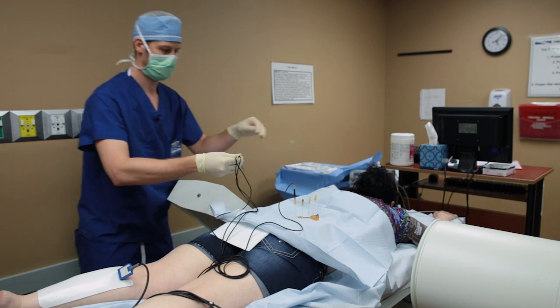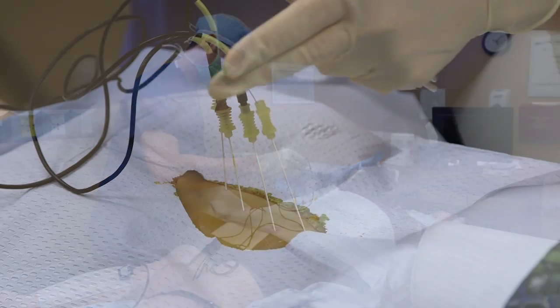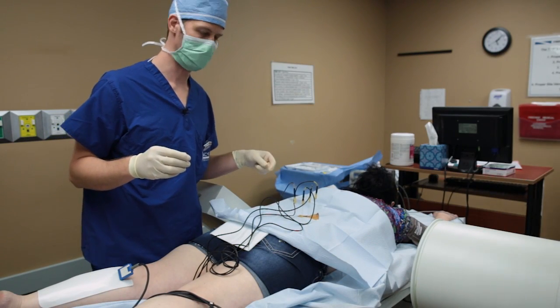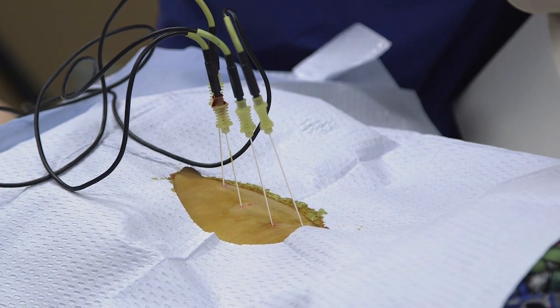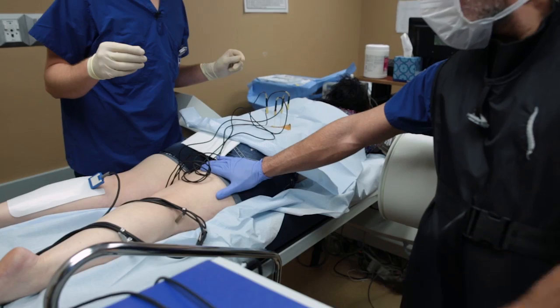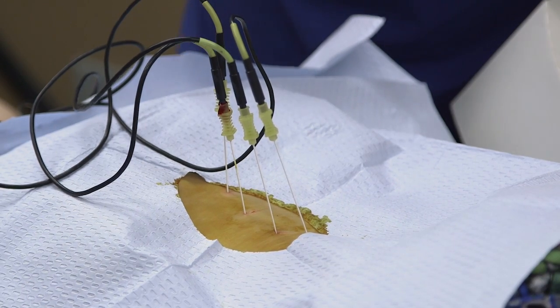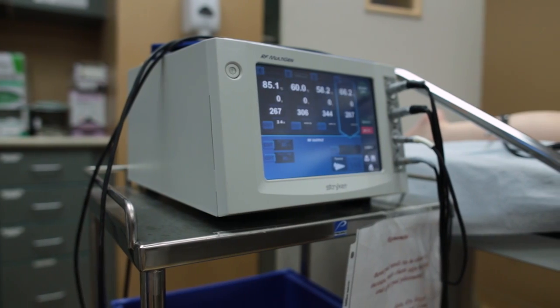These are very small nerves so sometimes they can grow back, but if you get very good relief for six months or more this procedure can be repeated in the future. The first step, we're going to send a small current through these needles — it may stimulate your back and you may feel your back twitching, which is normal and helps confirm we're in the right spot. We want to be near the nerve that innervates the joint but not near any of the nerves that innervate the legs. We can tell both by using the machine and by taking multiple x-rays.